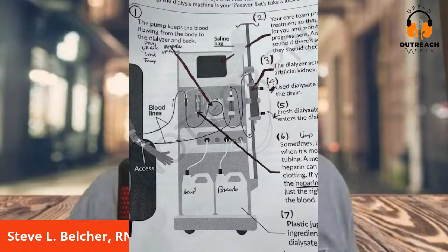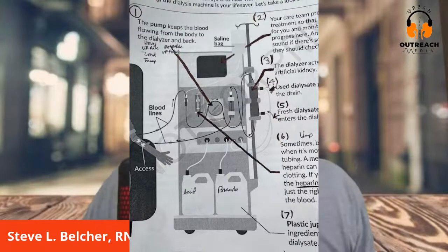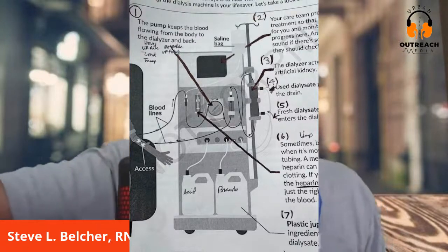So we talked about treatment. Everything is monitored from there. An alarm will sound if there's something they should check on. Now, when you move down to number three, to the right, that's the dialyzer. And the dialyzer acts like the artificial kidney.